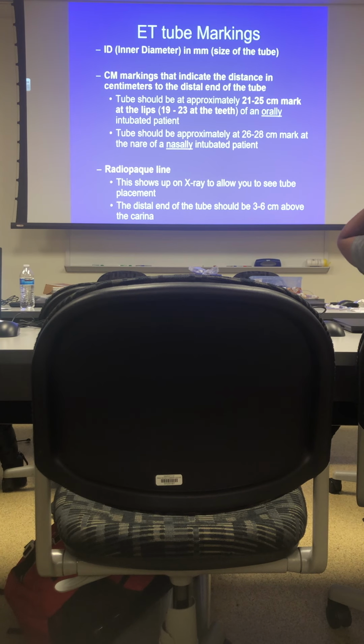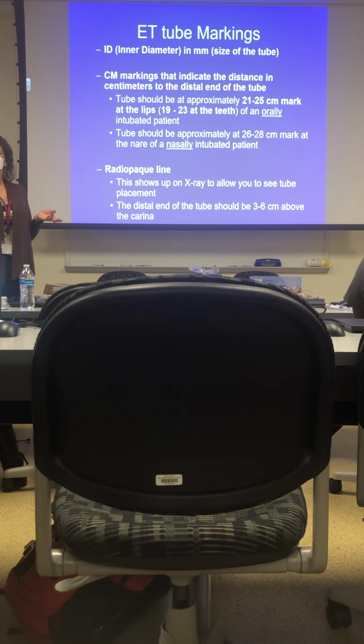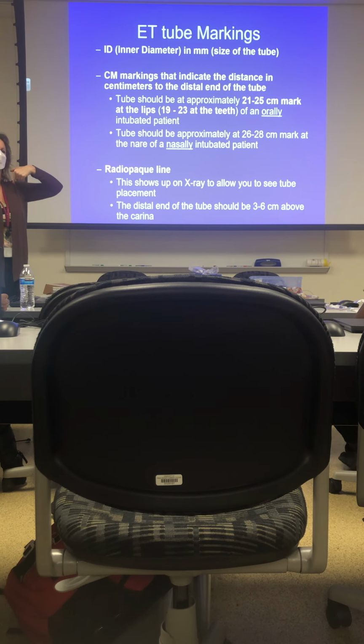But when we do it, there are some advantages to nasal intubation and some disadvantages. What do you think an advantage would be for being intubated? Having something in the back of your throat into your airway, would that be less comfortable or more comfortable than going through the nose and down into the airway? Which one's more comfortable for the patient? Nasally, because you've got that gag reflex at the back of your throat, and that would be very uncomfortable. So it's more comfortable to nasally intubate.